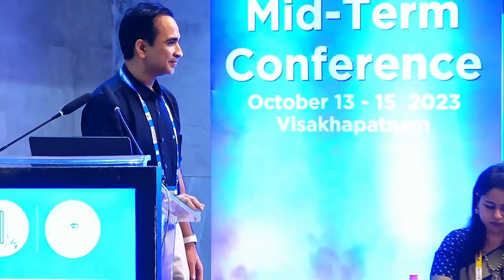So one way that you were rotating with the irrigation aspiration, that's a good idea. The other thing I do is, when we are doing viscoelastic removal, typically for toric IOLs, you want to go behind the IOL and remove the viscoelastic, and it rotates. So what we can do is keep the irrigation fluid on, and use the dialer with the other hand and just rotate it. That's the other option which comes in handy.